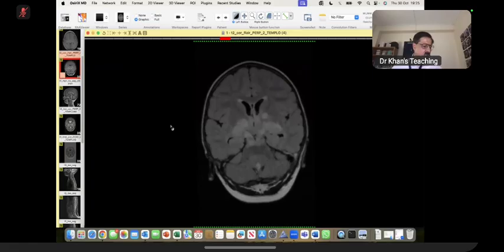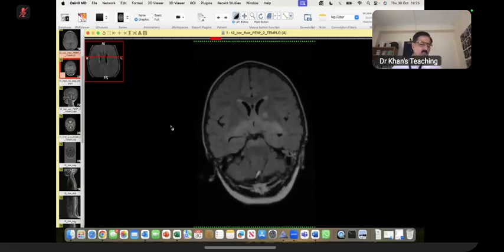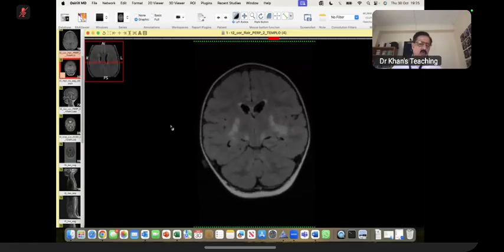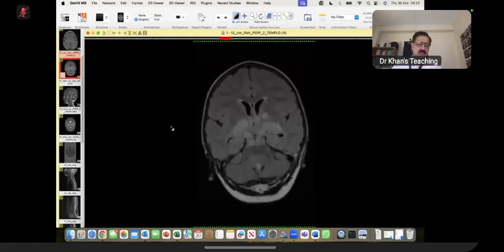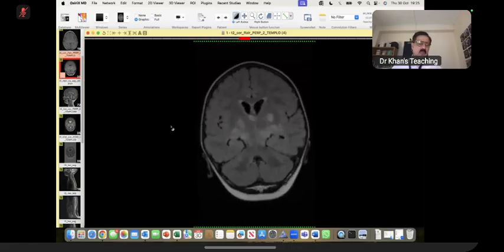So this was a case of NF1 because you could not reach the diagnosis. I had selected some questions for you, and in the exam also, they will select one or two questions for you. But if you don't reach that point, they cannot ask that question and they might go to the next case. And you are going to lose marks in some of the domains which I have told you. So this was NF1.